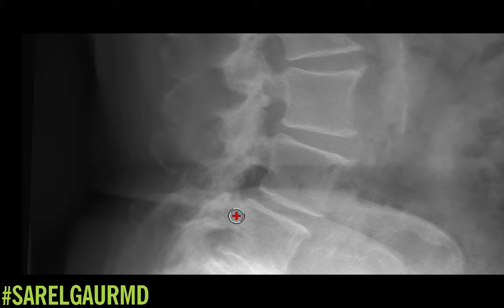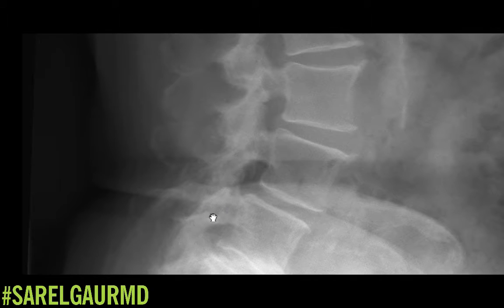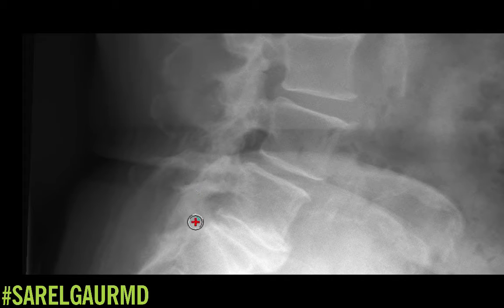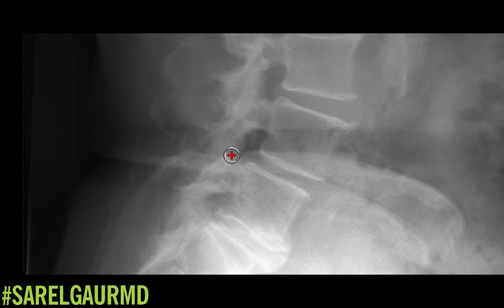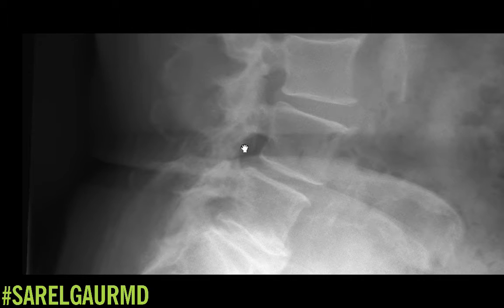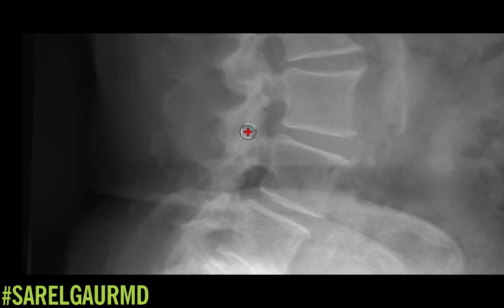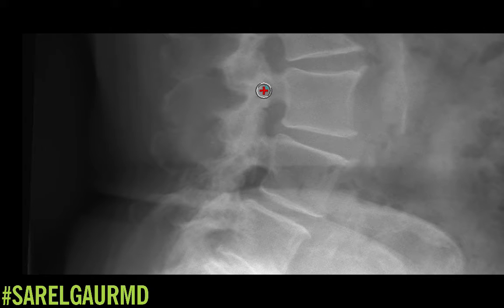I'm going to come back through the pedicles and look at the posterior elements. Something I'm noticing at L5-S1 is some facet arthropathy — some facet sclerosis. I'm noticing the same thing at a couple of different levels. Definitely sclerosis, which means facet arthropathy from about L3 down to L5. So there could possibly be central canal narrowing — something to think about.